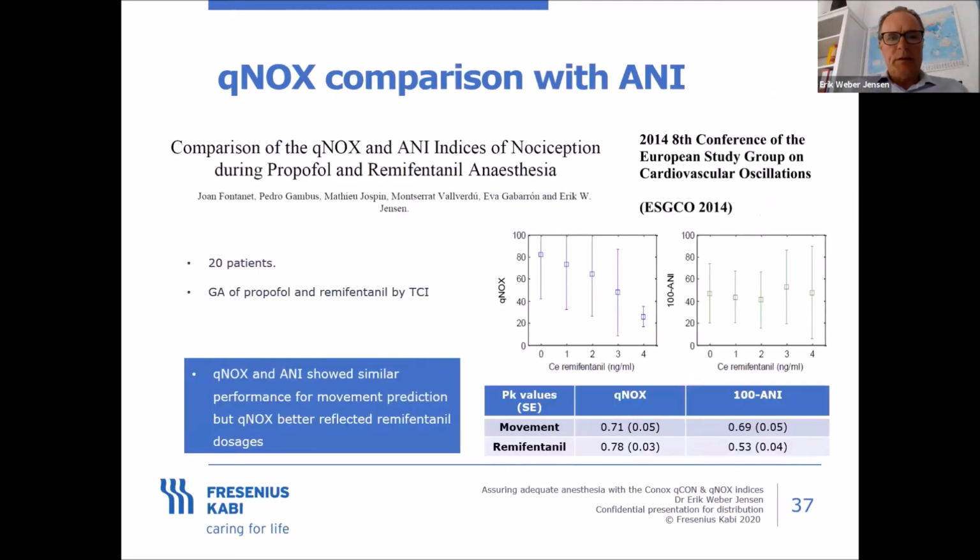In this study here, we see a comparison of the qNOX and the ANI, and we found that the correlation of the qNOX to the concentration of remifentanil, in terms of prediction probability, was significantly higher than that of the ANI.